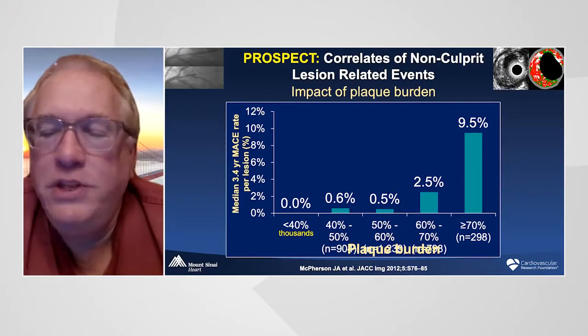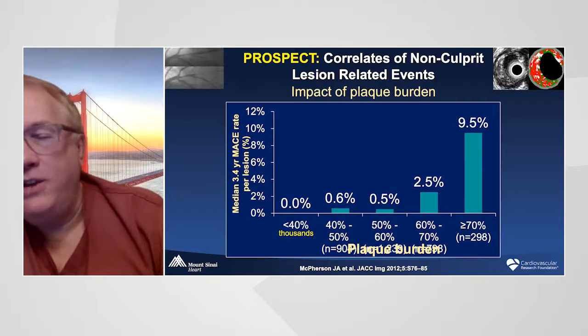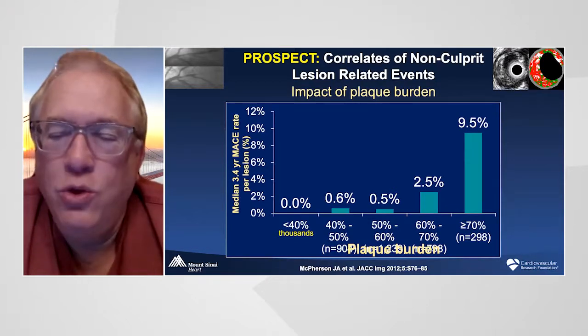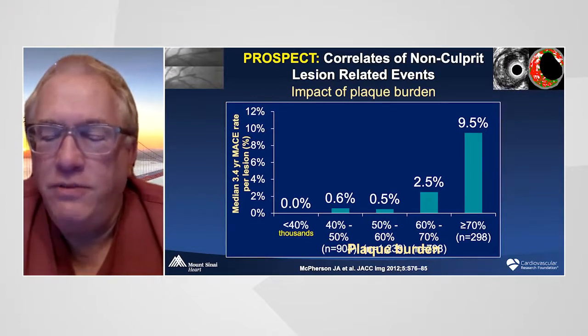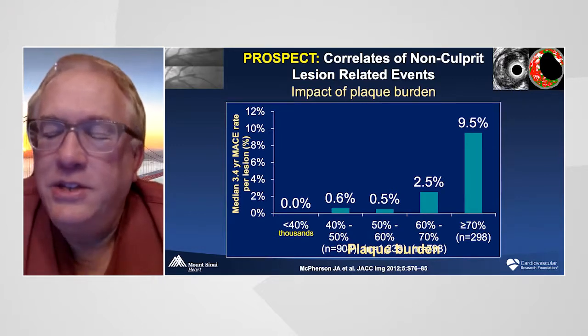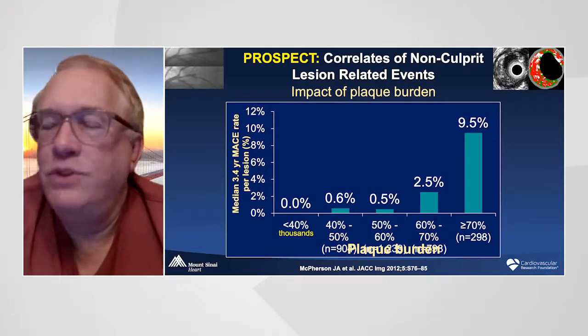Everyone had previously thought these lesions were mild, but they're mild angiographically, and the angiogram is just a terrible discriminator of what is going on inside the coronary artery because of Glagovian remodeling and other limitations of a 2D angiogram. It's not until you get to about 70% plaque burden that you start getting a significant incidence of major adverse events.